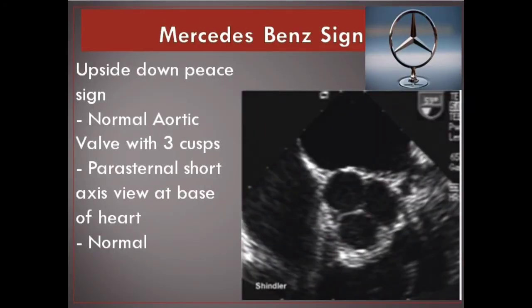Mercedes-Benz sign — upside down peace sign. Normal aortic valve with three cusps, parasternal short axis view at the base of the heart. Normal.